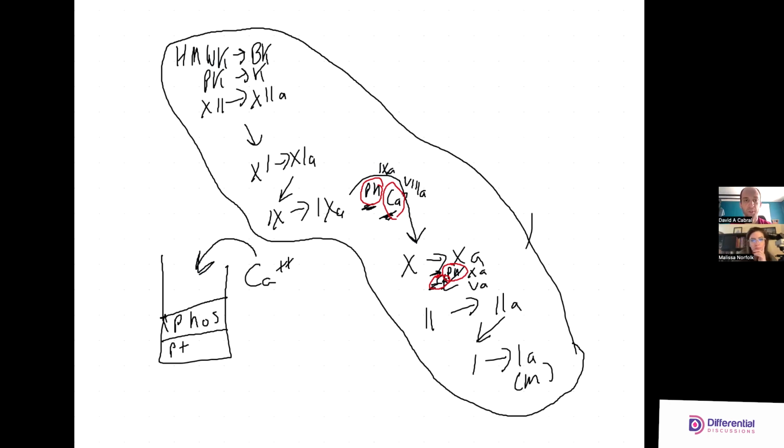It's detecting absorbance. And when the clot forms, the absorbance on the receiving end changes because now you have this opacity, right? These solid fibrin strands that show up. And there are a lot of complicated maths. I don't know that this is the place to go over those. I'm certainly not prepared. But yeah, there are complicated maths for both the APTT and PT.